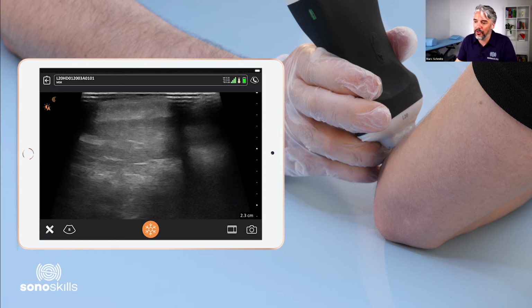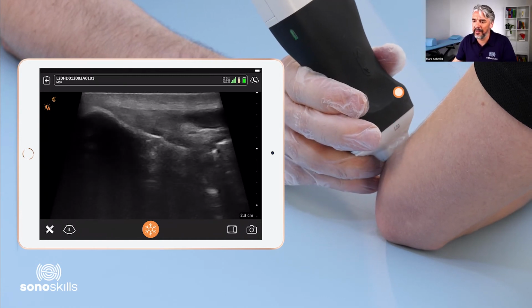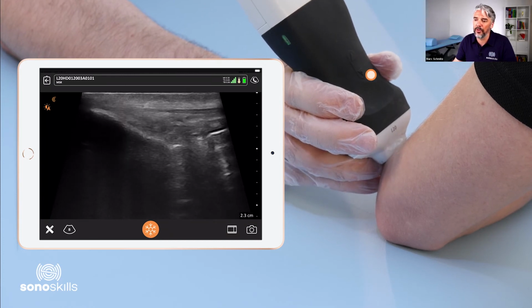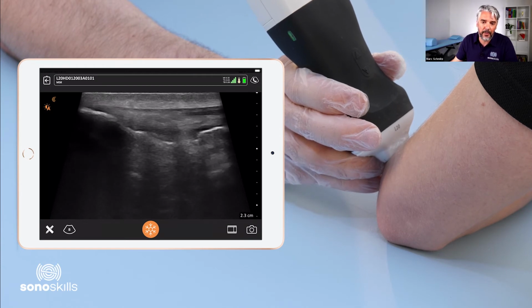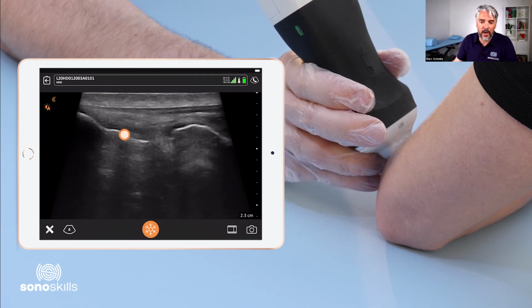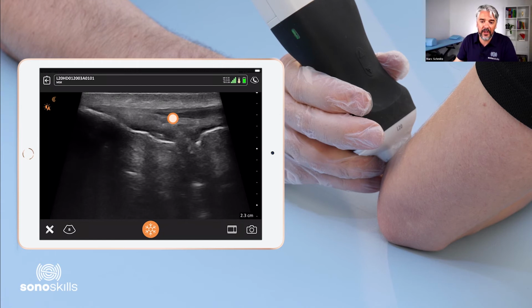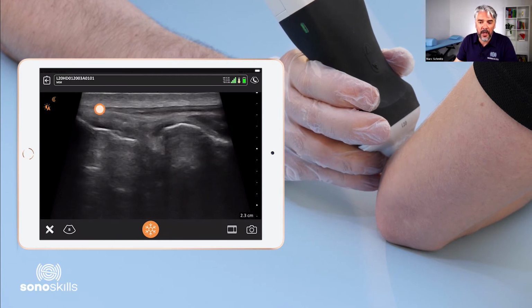We're going to place the transducer on top of the lateral elbow. If this is 90 degrees, if this is 0 degrees, the transducer is roughly 70 degrees on top of this lateral elbow. What do we see? We see the lateral epicondyle. It slopes down to the capitellum of the humerus. And on top of it, we can see the tendon, the common extensor tendon. Observe that the tendon is flat. It's a horizontal line. This is important to note.